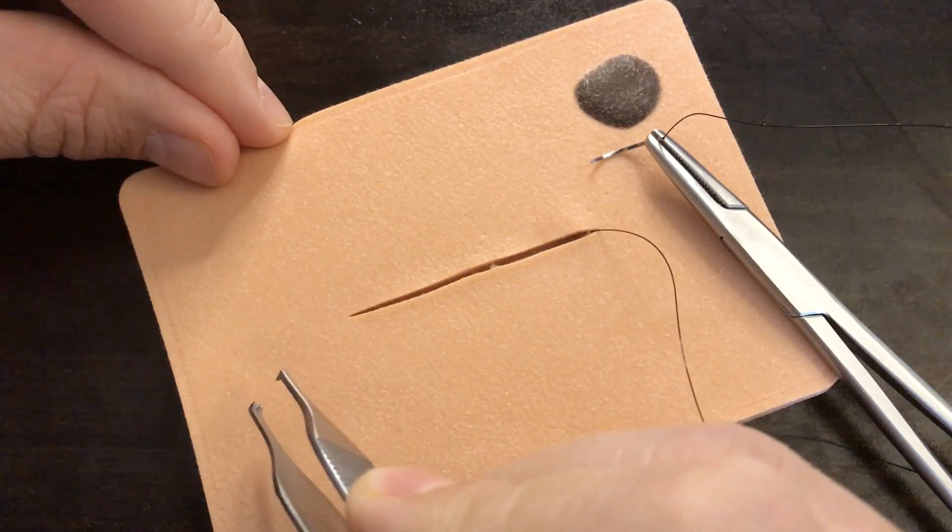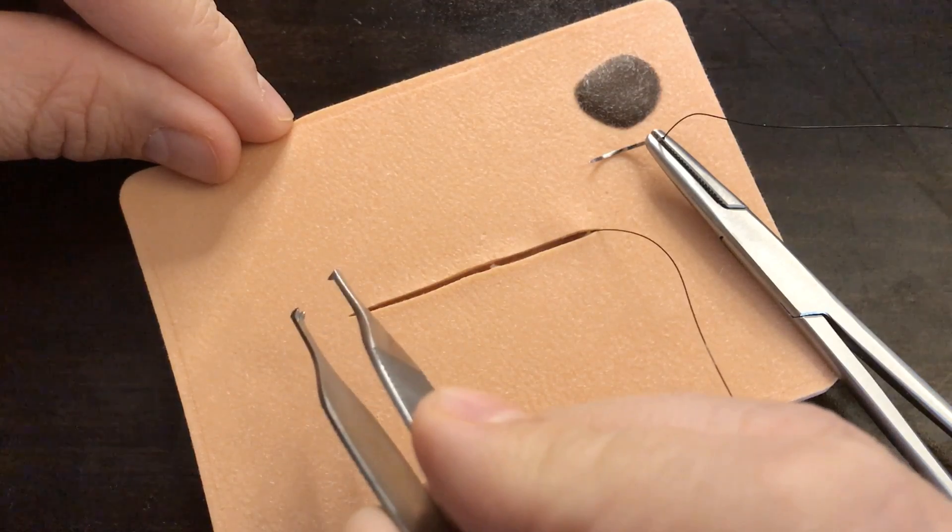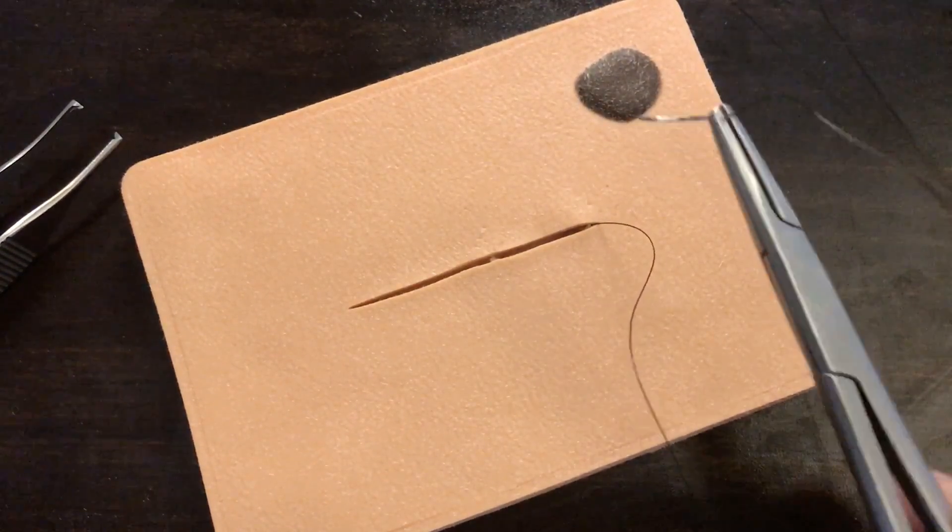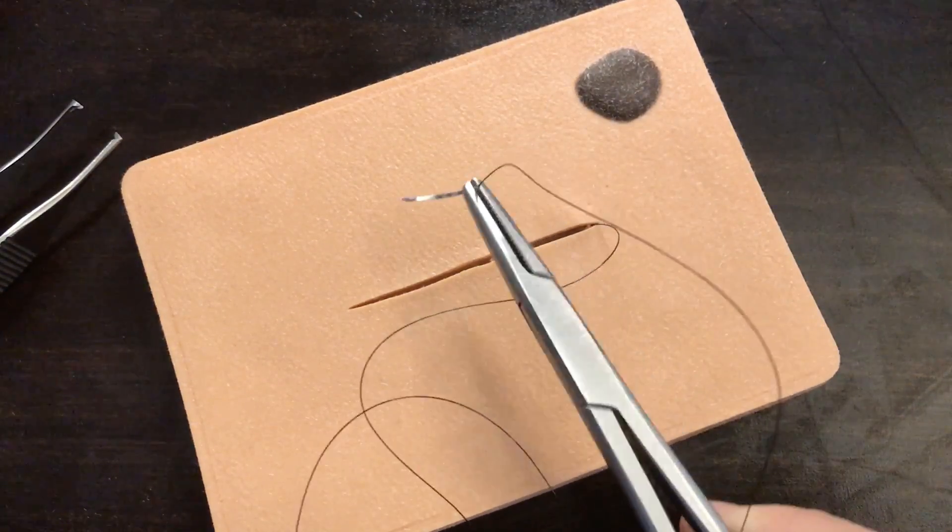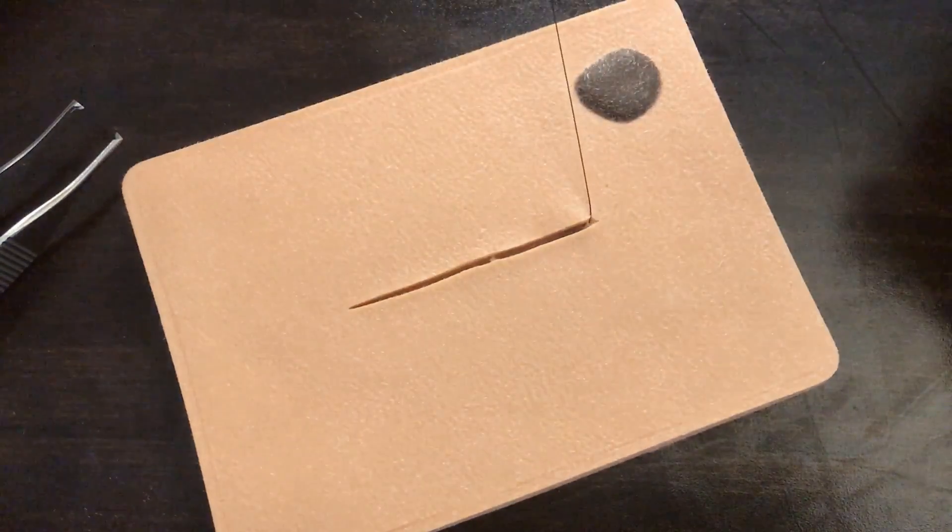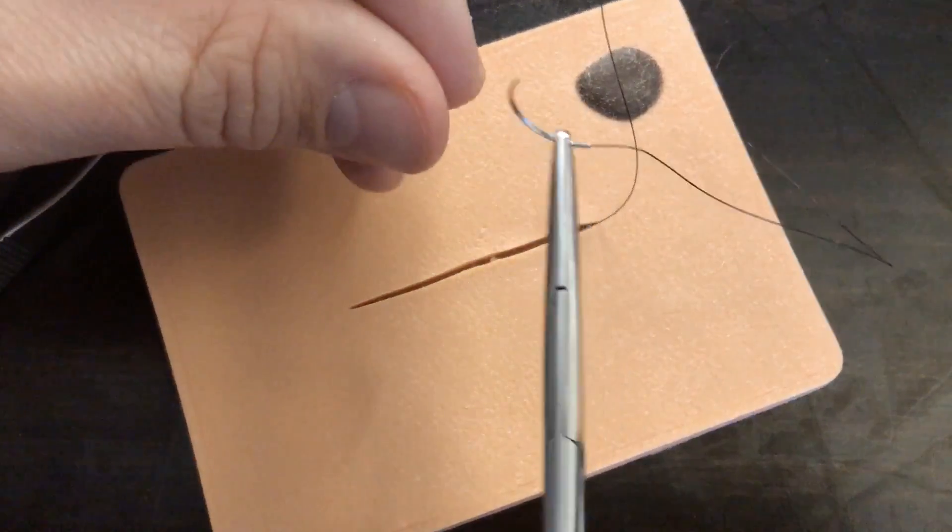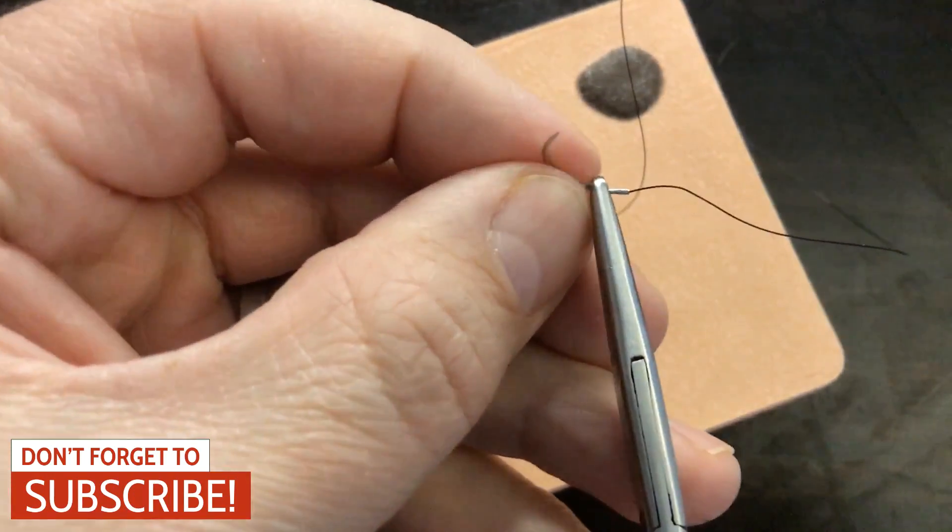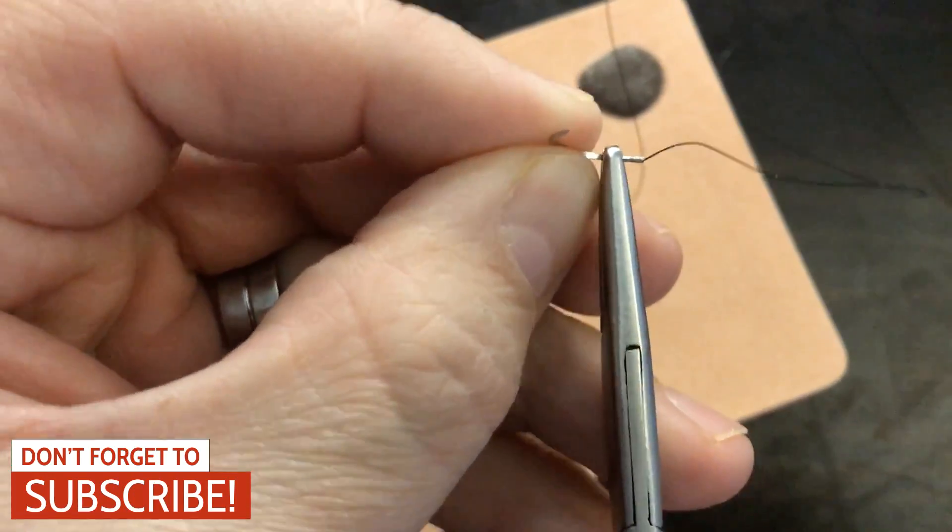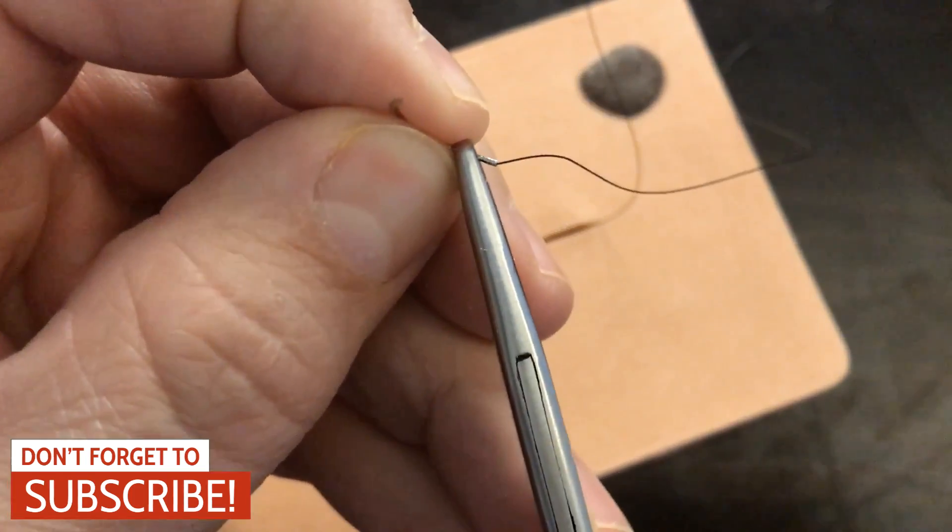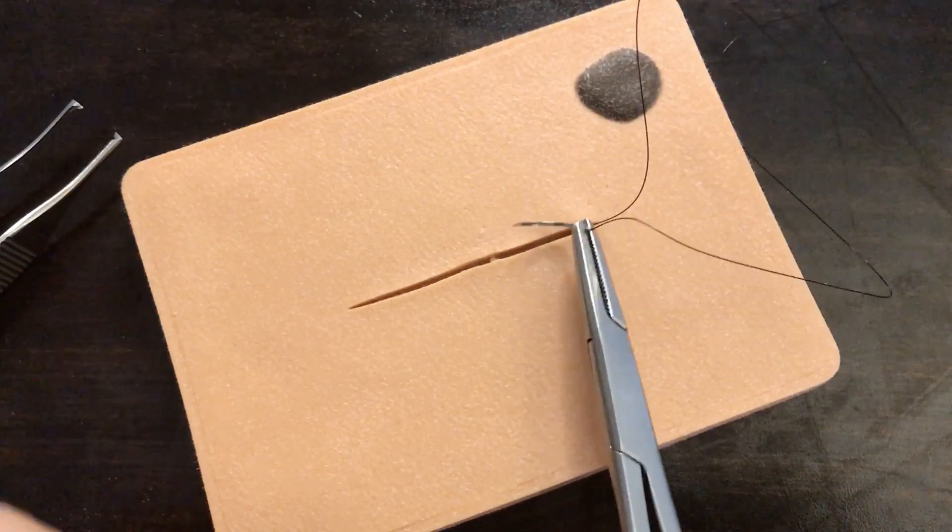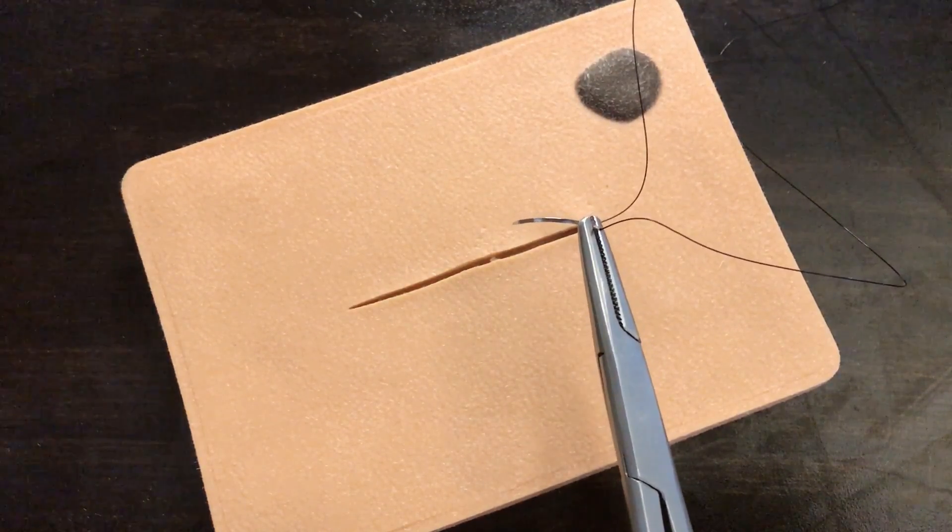And that's where I'll finish in this video with what's called an Aberdeen knot. Now because we're not going up and down like we do with other suture techniques, we're just going back and forth in the same horizontal plane, I tend to find it easier to have my needle loaded a little bit forward. Notice how I am not at 90 degrees. If it was at 90 degrees it would look more like this. But I want to load it a little bit more forward because that gives me a better angle as I'm trying to move in this direction.